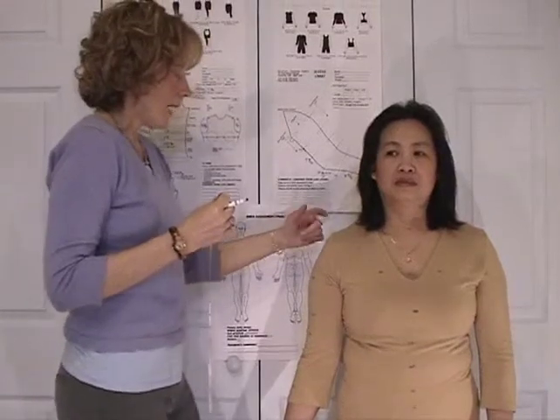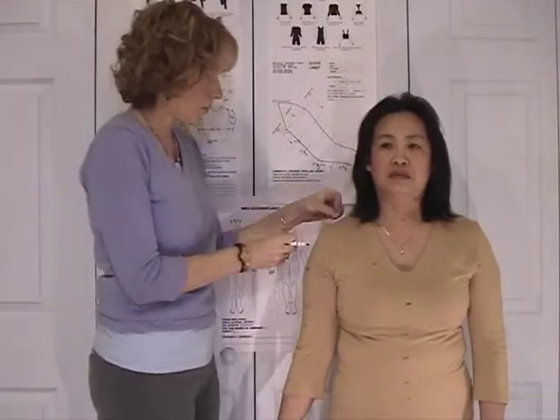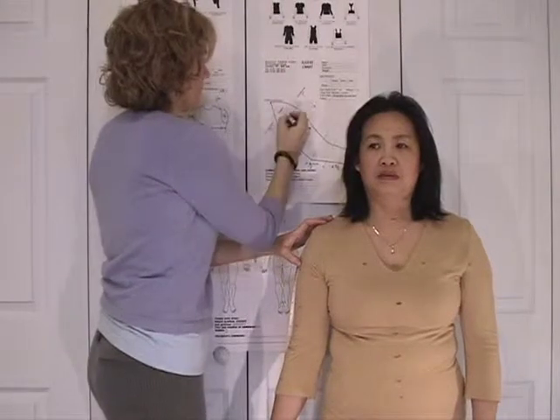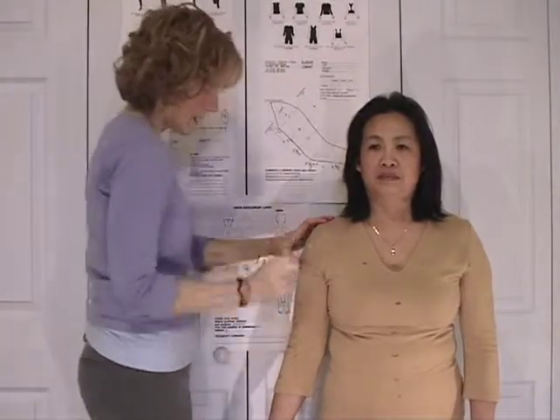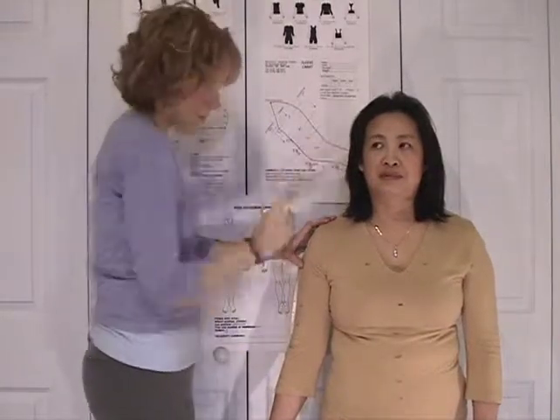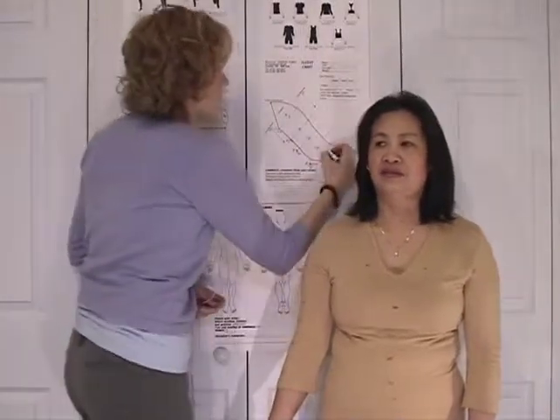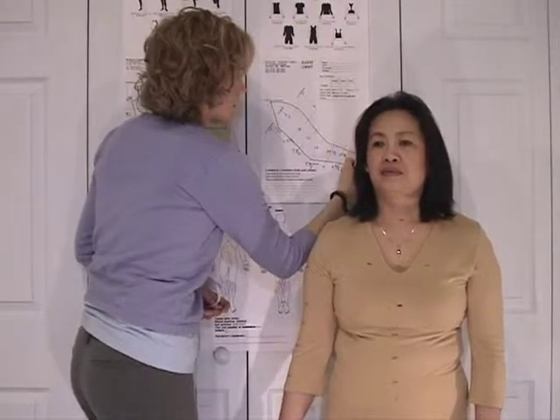The difference in measuring lengths has to do with where you start. When measuring for a sleeve attached to the vest, your zero is at the acromial process point. So from zero, you'd measure down — for example, five, eight, ten inches — and you have all your lengths written right down in the center of the diagram.